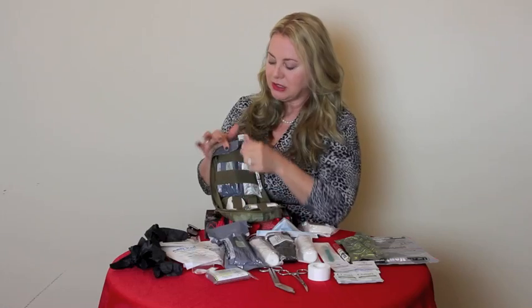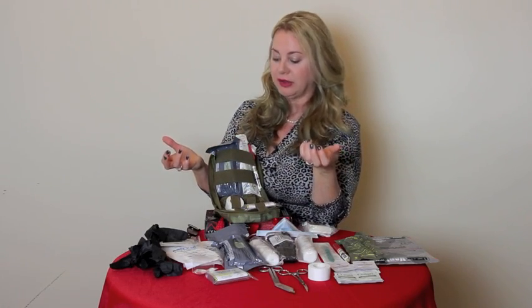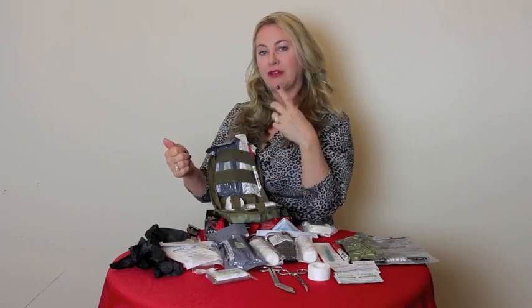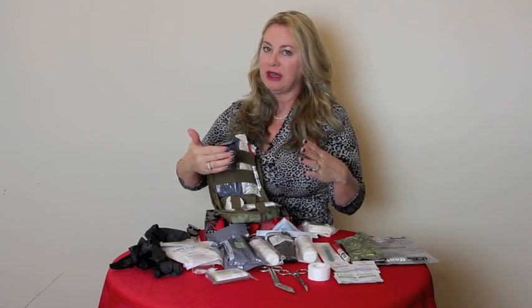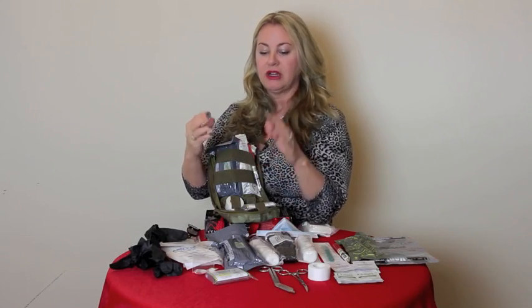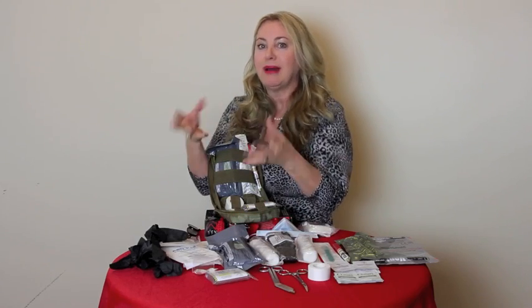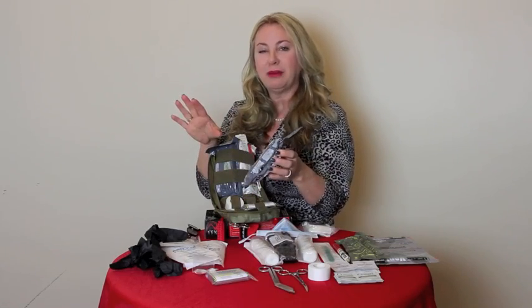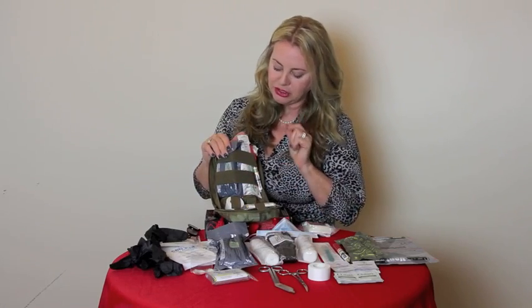Now, you take this, you open it up. It does have a double package to open up, which is great because you definitely guarantee sterility if you're getting into two packages. You have a pad, you have an elastic wrap, you have a pressure clip, and this will create not a tourniquet, but it will create a certain amount of pressure if it's wrapped properly over the wound. Now, you're not going to want to do this until after you've stopped the bleeding. But if you've stopped the bleeding and you're worried about it starting again, putting a pressure dressing on it will kind of help guarantee that it probably won't start again. So that is excellent for dressing a wound after you are finished with the bleeding.